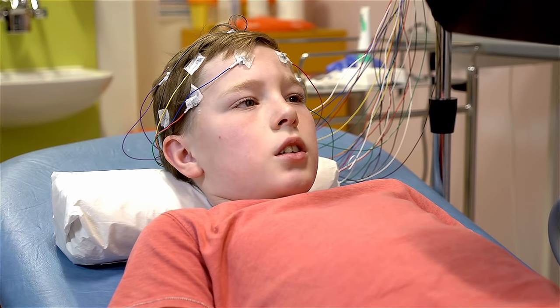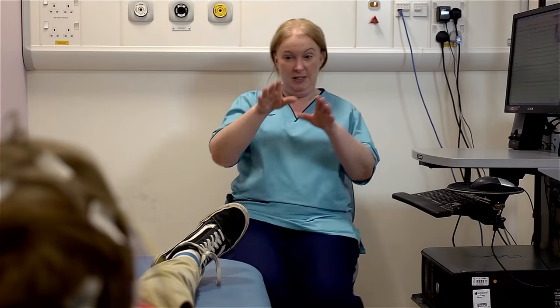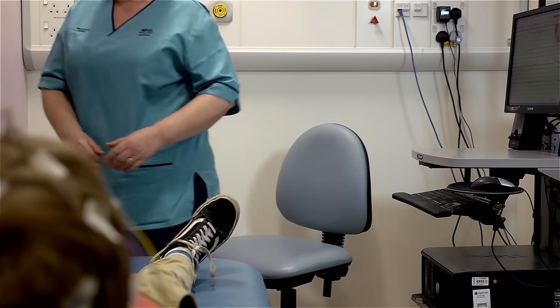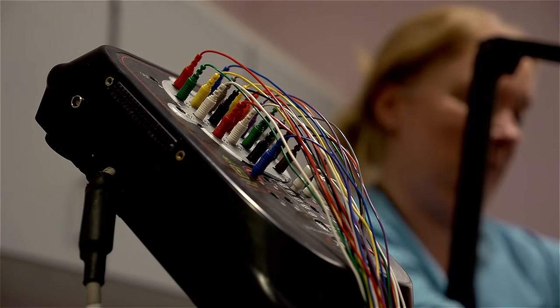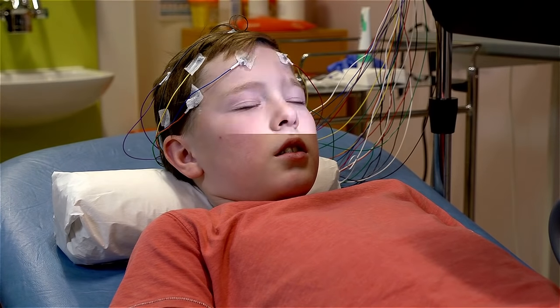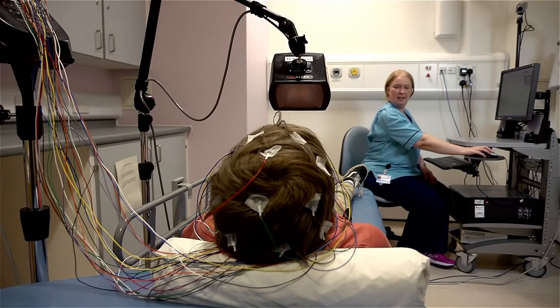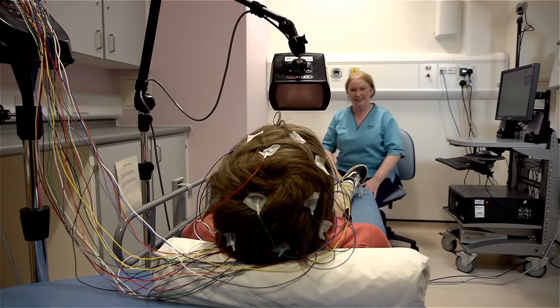It passed really quickly. You did it so well. Now we're going to do a bit with a flashing light. I'm going to come and pop this light in front of you. If you can close your eyes again for me. You can open your eyes now — that's the light finished. Do you feel okay with the light? Yeah. It's a bit funny to watch.